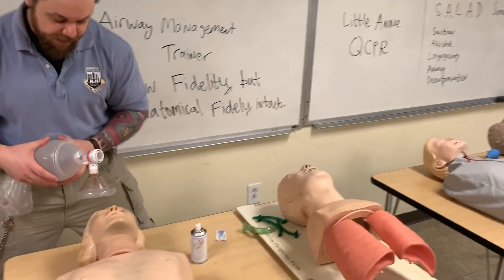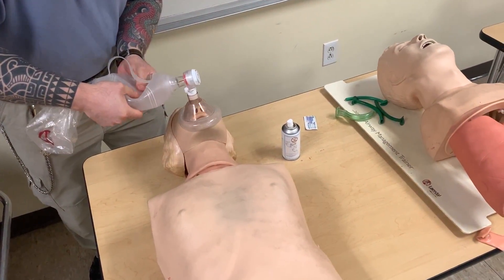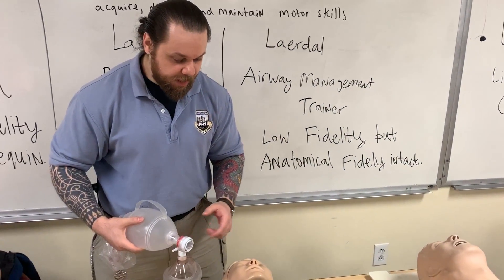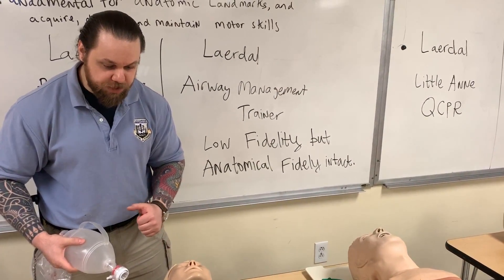If I apply my BVM here and go ahead and ventilate, absolutely no chest rise is seen. So for the initial phase, for the novice, you want to employ this airway trainer. This is, by the way, Laerdal Resusci Annie — the old school CPR mannequin.